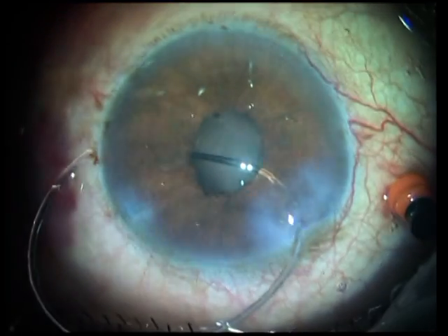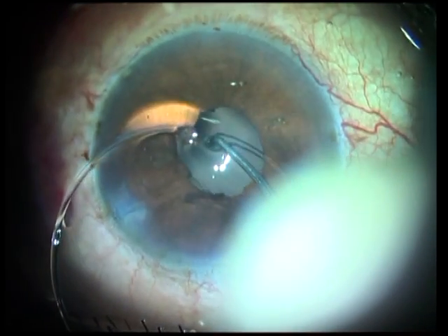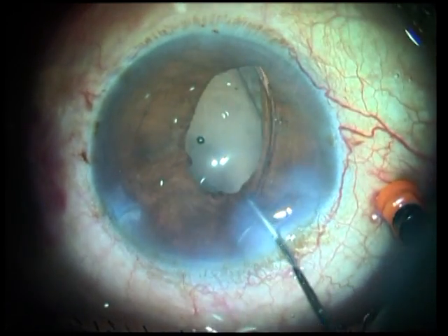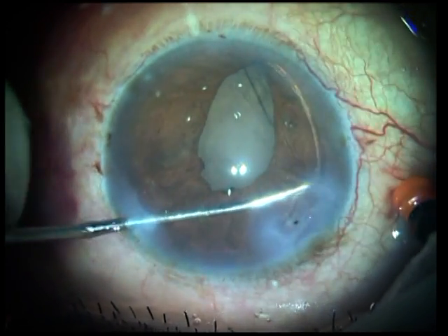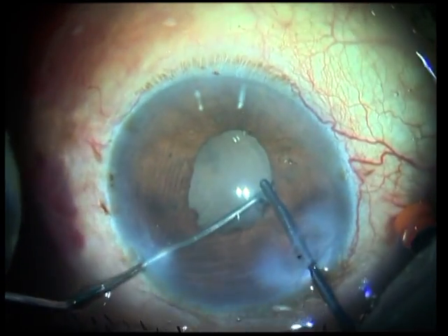Here's another situation where a CTR is being implanted; however, the pupil is small. Some viscoelastic has been instilled in an attempt to dilate the pupil but visibility is still bad. Here is a technique that I find many people adopting, which is to use a Sinski hook to engage the dialing hole of the CTR and try to implant it in this way. But you can see that this is quite unpredictable — as seen in this case, the first time it landed above the iris.